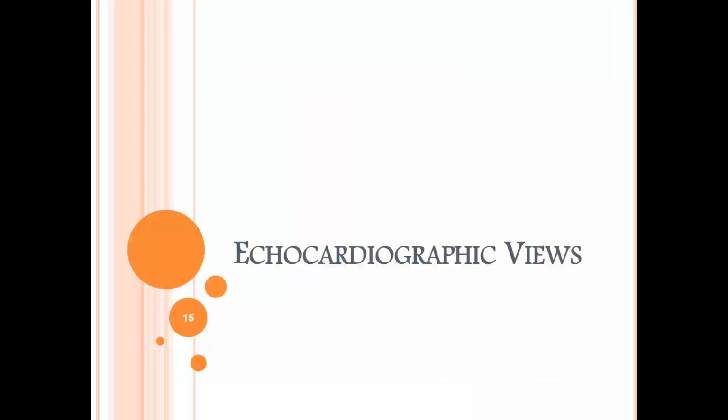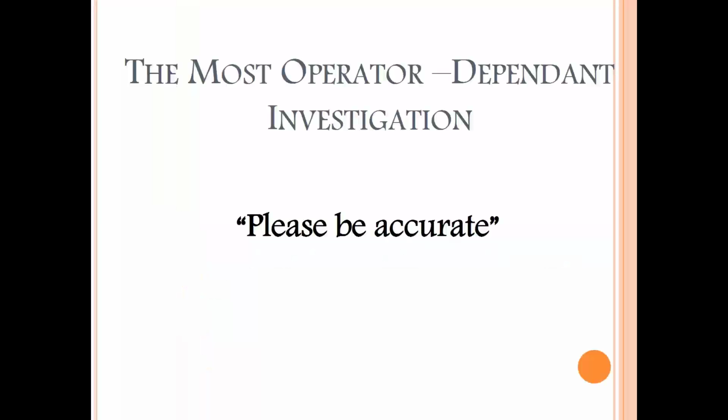And now we come to our basic echocardiographic views, by the transthoracic. As echocardiographic examination is one of the most operator-dependent investigations, and according to your report, many crucial decisions will be taken. Please be accurate. Repeat yourself once and twice, and if you're not sure, repeat again for the patient's sake.